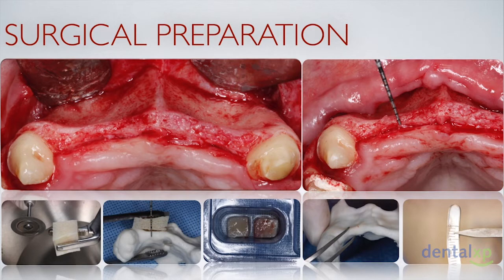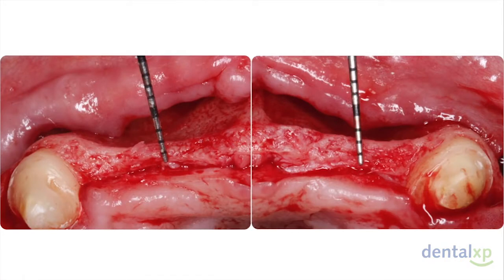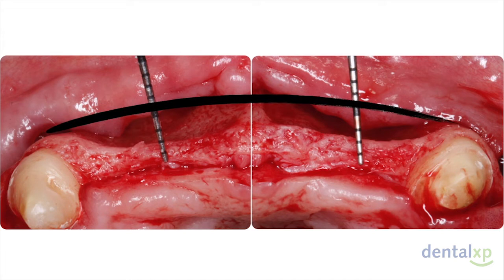Also, we have to bear in mind that when we're approaching a large span or large augmentation, with our incision designs we'd like to keep them at least one tooth away from the surgical site to avoid any overlap of the incision margins over the proposed grafted area. And here's a closer look at the site. As you can tell, we're going to be needing some substantial augmentation to restore the lost tissue volume as a result of the trauma to this area.